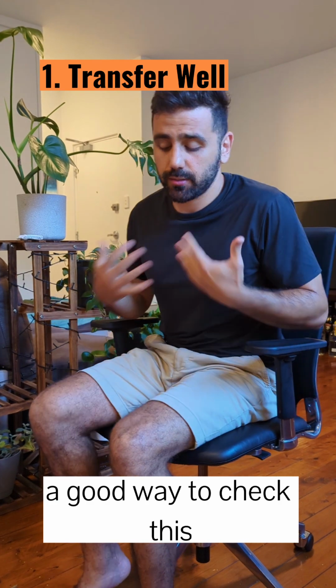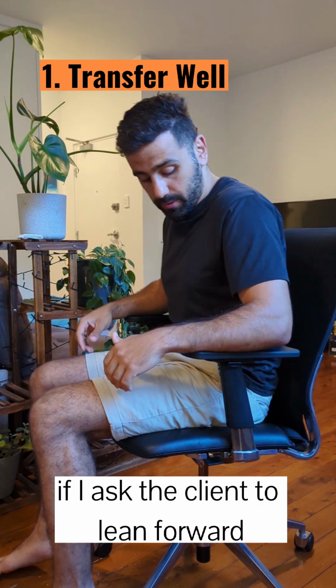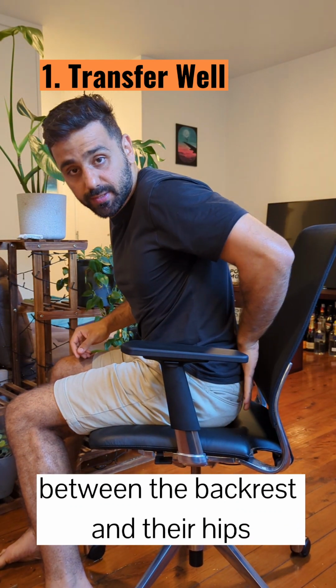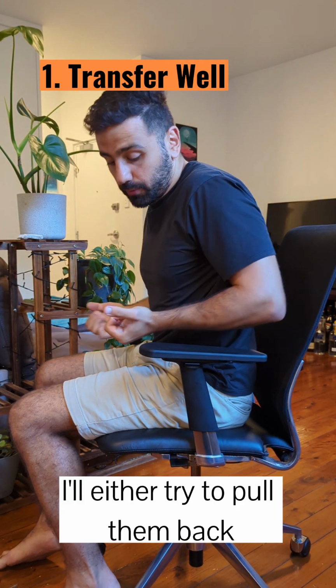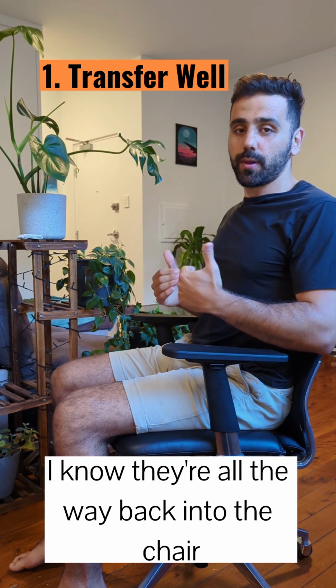A good way to check this, usually what I do is I ask the client to lean forward. So if I ask the client to lean forward and I see there's a bit of space between the backrest and their hips, I'll either try to pull them back or I'll ask them to push back a little bit more, and that way I know they're all the way back into the chair.